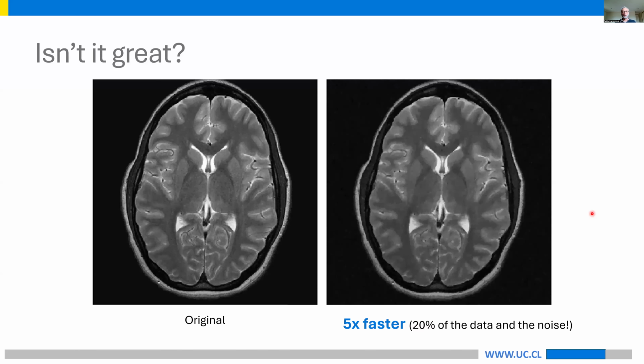Now, in the context of low field, probably you don't want to acquire less data. You're going to do fully sampled, but you can still use compressed sensing, not for recovering the undersampled data, but to reduce the noise. So you can reconstruct your image from this fully sampled data, forcing that it is compressible and making the data consistency not exact. In that way, you can reduce the noise.